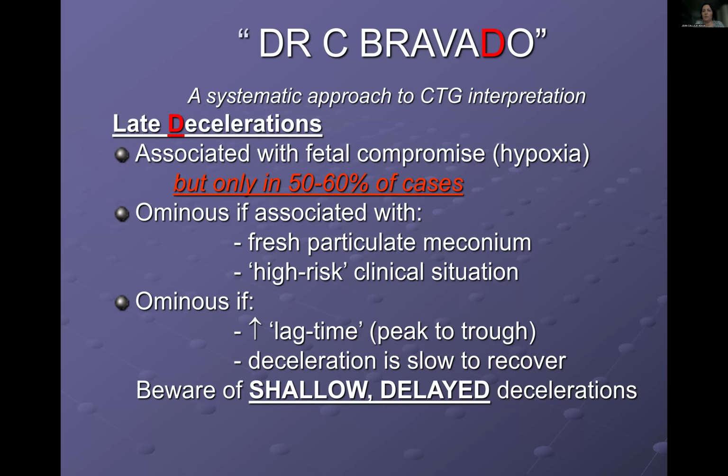But even so, and I'm sure you've experienced this, you get cases where the CTG looks horrible, and you do a cesarean section, and the baby has a normal Apgar score. So you wouldn't know unless you've delivered the baby.